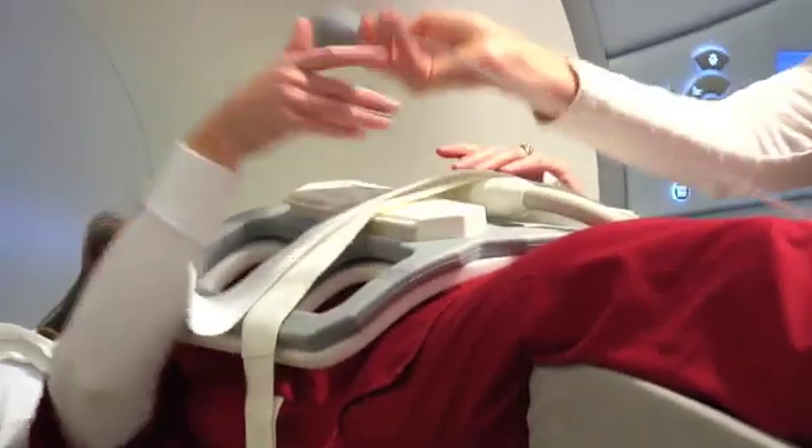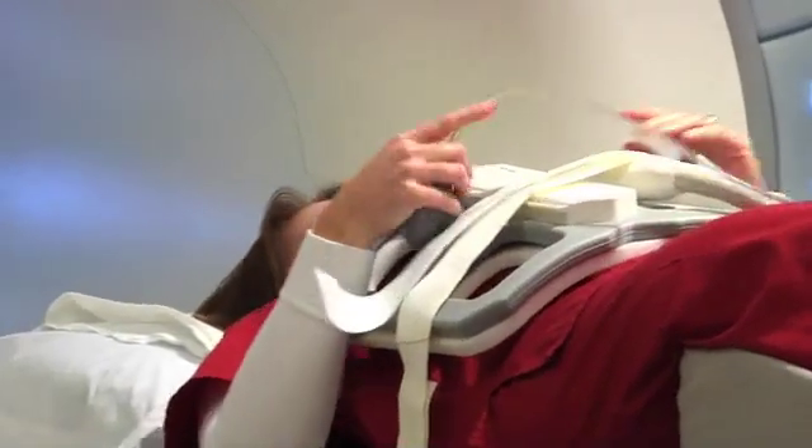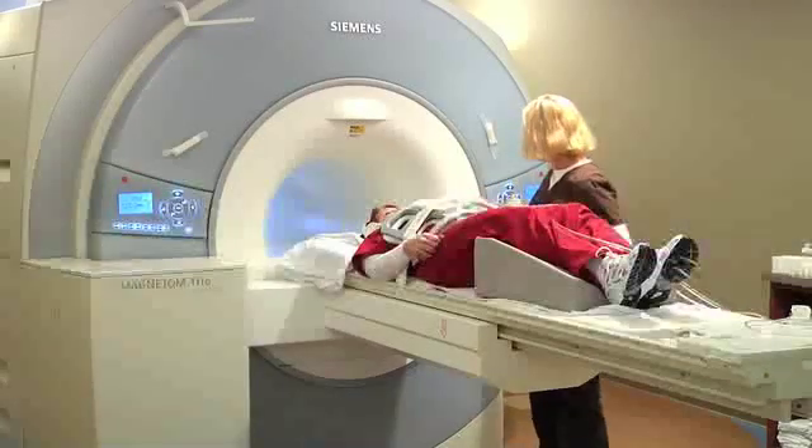In addition, we're also going to give you breathing instructions to hold your breath during the abdominal MRI. We're also going to give you a call button, in case you need to stop your test and contact the MRI technologist. Most abdominal MRIs require an IV contrast injection, so keep that in mind when you come in for your test.